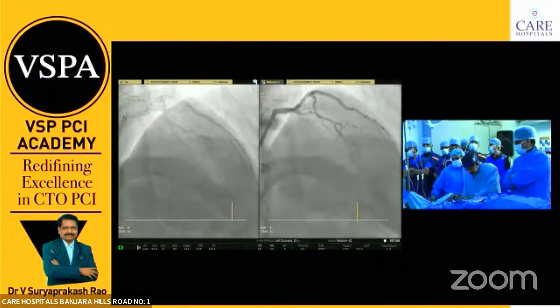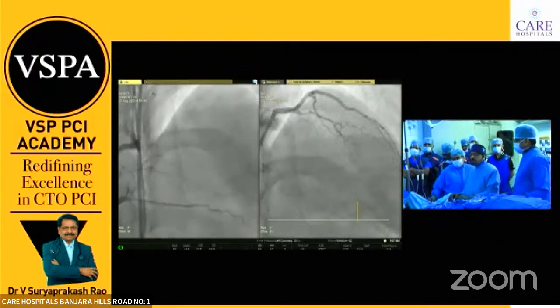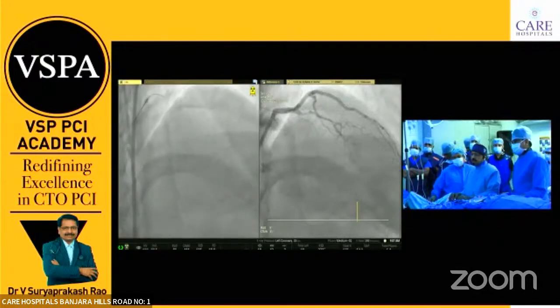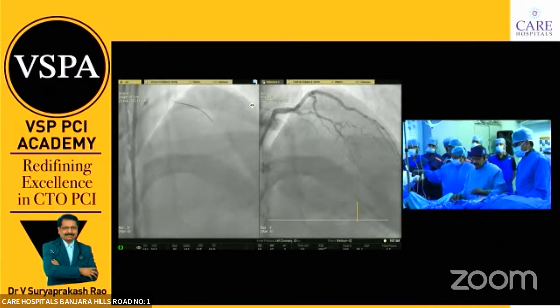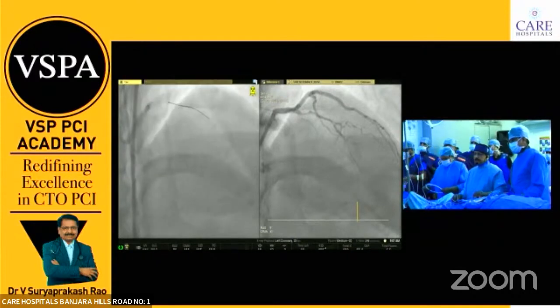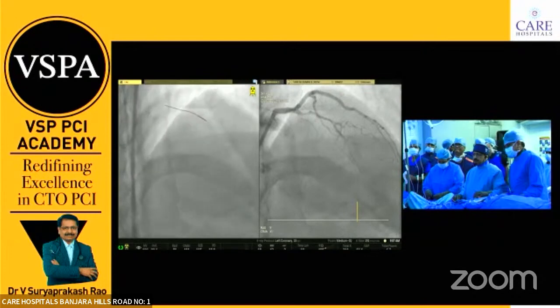I took a 135 Corsair along with a Cyan Blue wire, and I will negotiate this to the LAD. In the cranial view, it's easy to track. This is the first step I have done, and the next step is tracking the microcatheter to the tip. Now I took the microcatheter to the proximal cap.